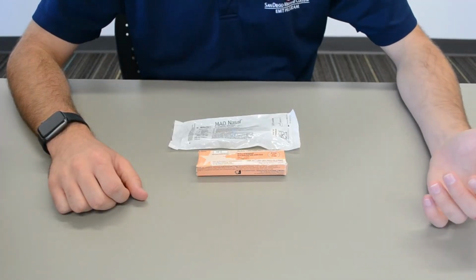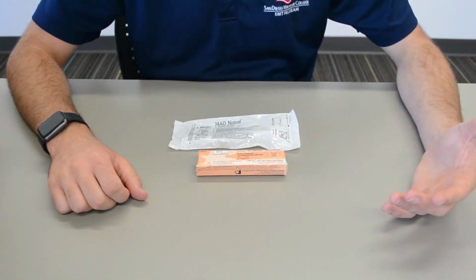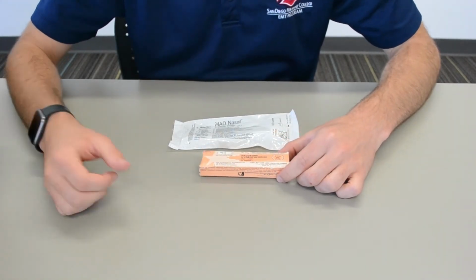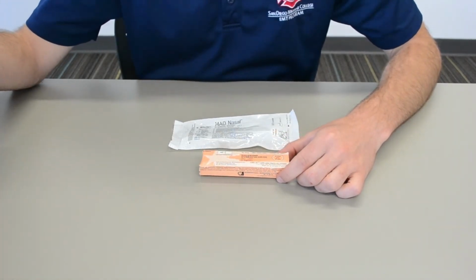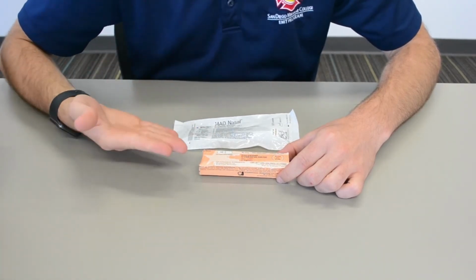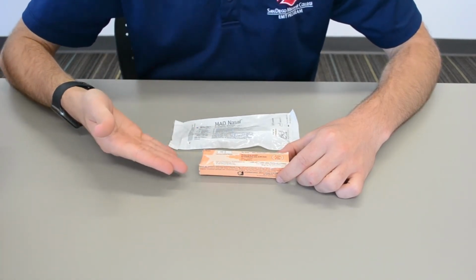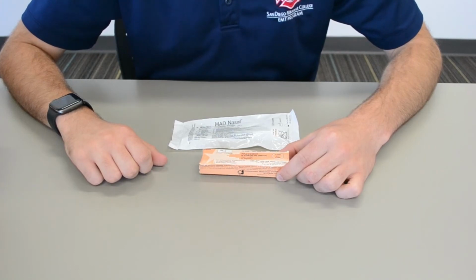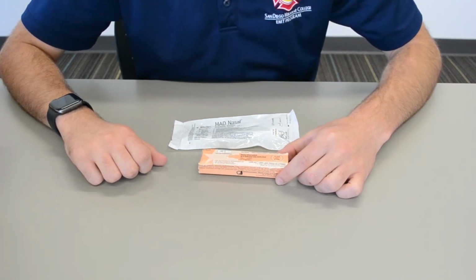Alright, so when we get into setting up for the administration of Narcan, one of the first things we want to do any time we have any sort of medication is our 5 rights. So this is the right patient because it's the right indication. This is an opioid overdose, so this is the right patient for this medication, which is Narcan. So we've got our first 2 of the 5 rights there. The route for this is going to be IN, intranasal. It's 2 milligrams per 2 mLs.